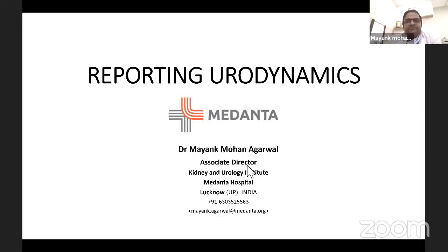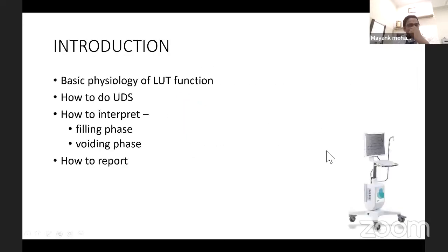Right. So, good evening, everyone. Sorry, the title is not correct. This talk is about how to plan a urodynamic study using basic equipment. You don't have to have a very expensive imported machine. Whatever machine you have, what are the minimum requirements? How do you set it up? How do you do it and how do you interpret? I will try to make it as simple as possible.